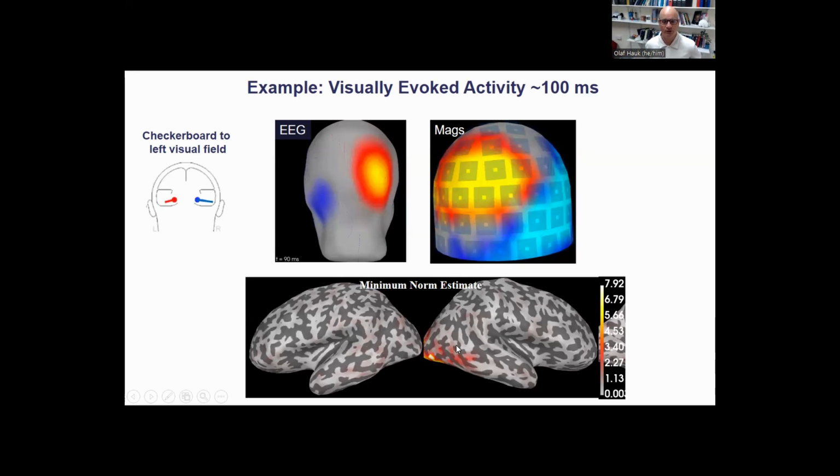I mean, visual cortex, or occipital cortex, is usually quite a nice area to study with MEG. It's close to the sensors, with good coverage. So this is the kind of spatial resolution you can expect. It is probably just a small patch of cortex somewhere that produces this activity. It is a bit more distributed. Also, if we looked at the bottom of the brain, you would see a bit more distributed source, but it's clearly right lateralized. So this confirms that we have a very lateralized response, and it is in occipital cortex.